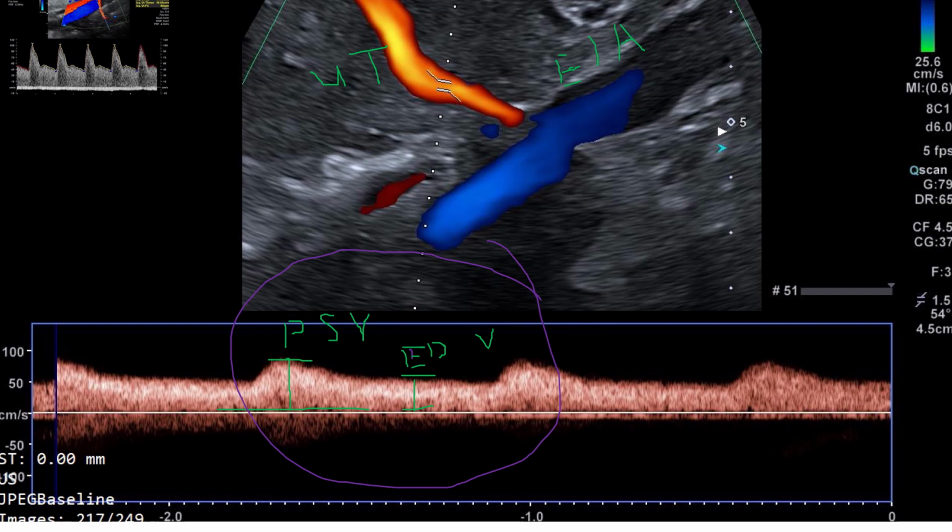So you go on either side of the flank of the abdomen, then you turn the patient slightly, 20 degrees or less, so that you can identify the uterine artery there. Then you look where it crosses, like that. This is the waveform that you must understand or know how to interpret. Okay.